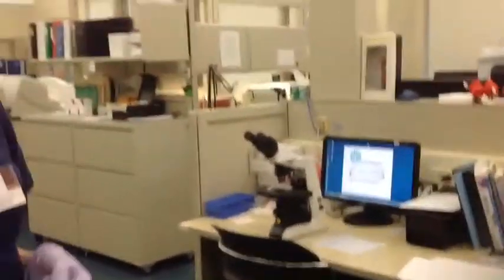This department over here is hematology. This is where we do complete blood counts. And we actually use the microscope to look at blood smears to look for red blood cell morphology and also the white cells. And we can do a differential on the different types of white cells.